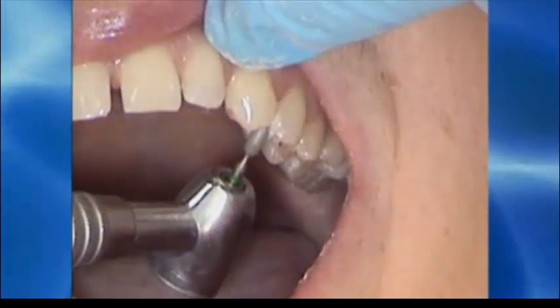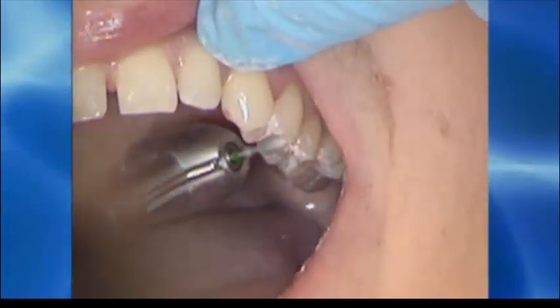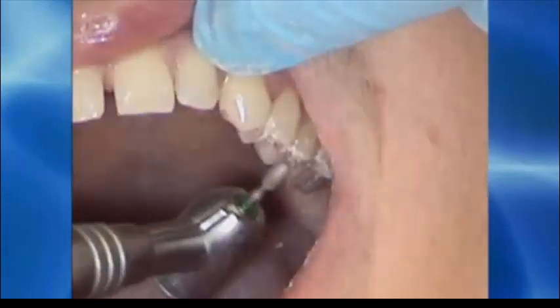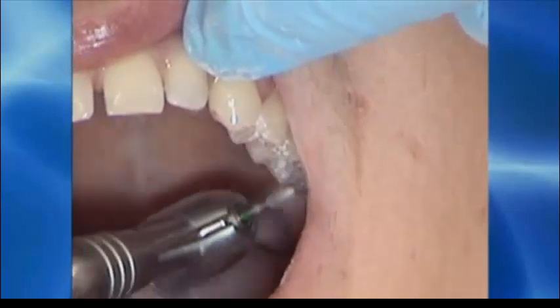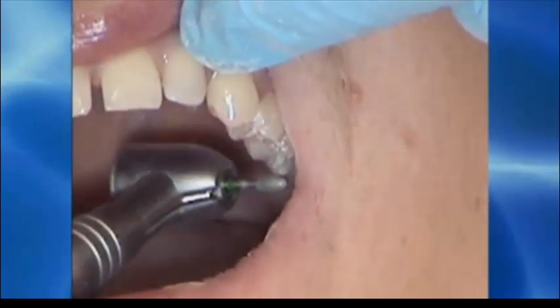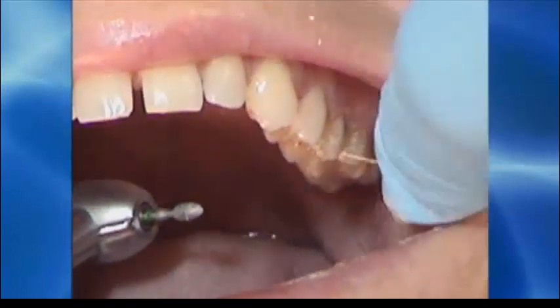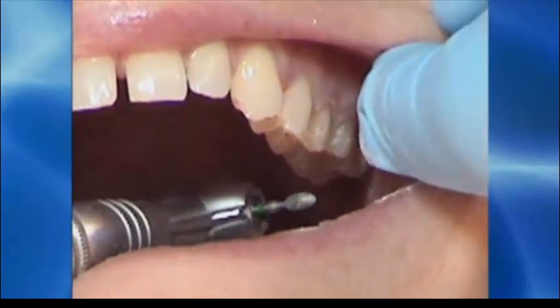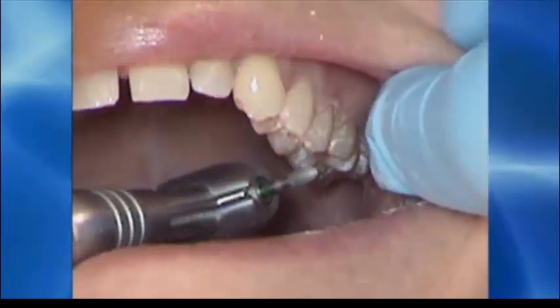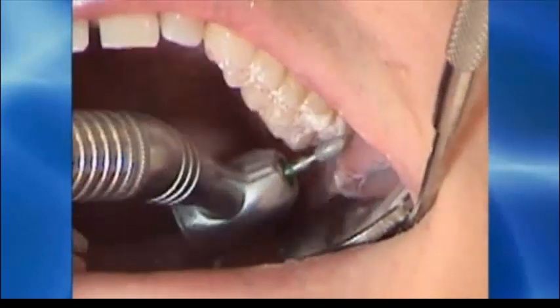The counter adjustment on the upper arch, again refining the markings that are in and around the central fossa and marginal ridge. You see I'm leaving the contacts that are in the central fossa on the first premolar. I'm trimming around that mark. I'm trimming around the cusp of the upper second premolar, and on each tooth I'm looking to make the marks almost not surrounded by any slightly inconsistent marks, no scratch-like marks.